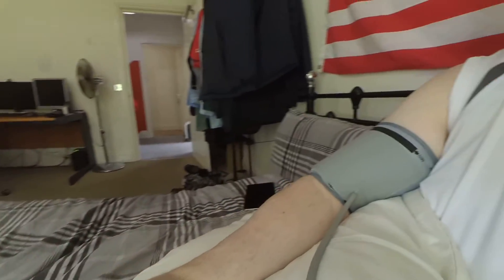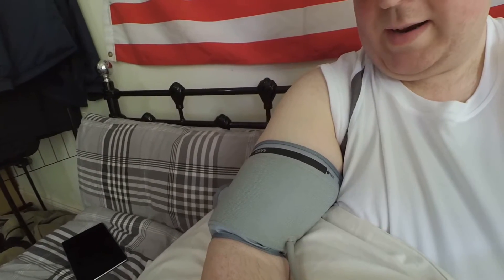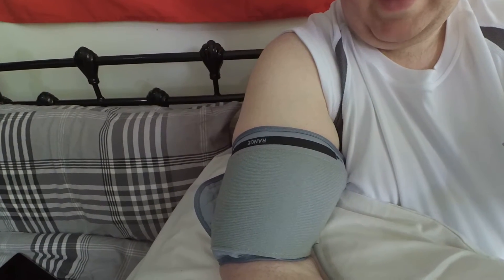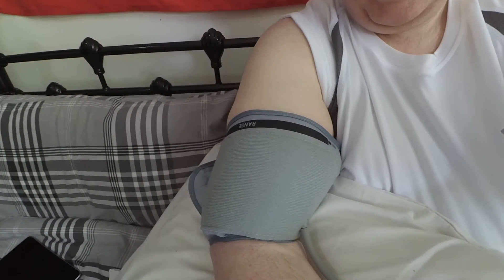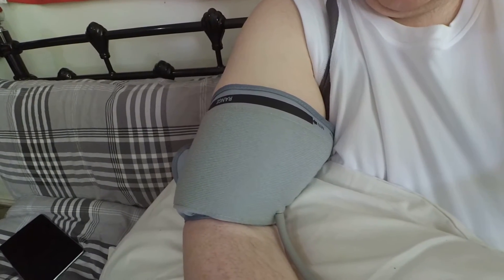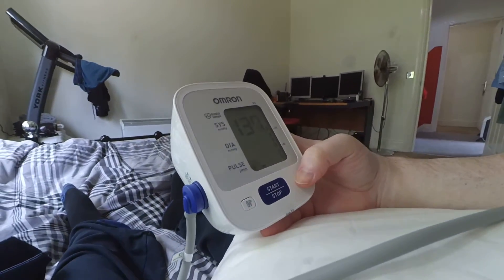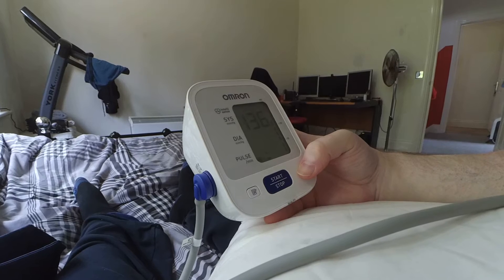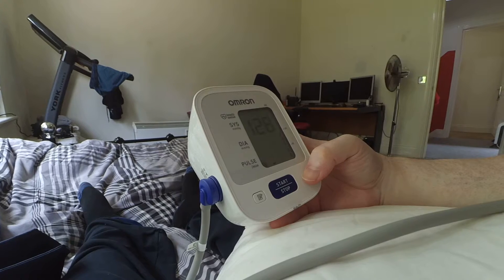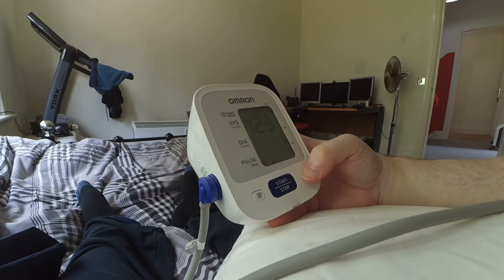There we go — we can hear the Omron M2's pump starting up, some high quality Vietnamese craftsmanship! We can see the armband visibly inflating — we can certainly feel it inflating. Oh my goodness, that is quite unpleasant, that is quite unpleasant indeed. There we go. It's doing its thing, doing its measurements — hopefully we should have a result fairly soon.